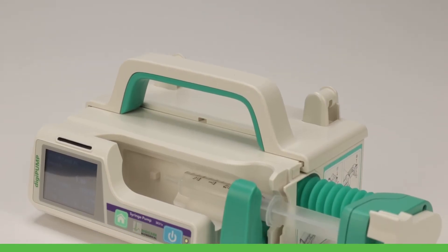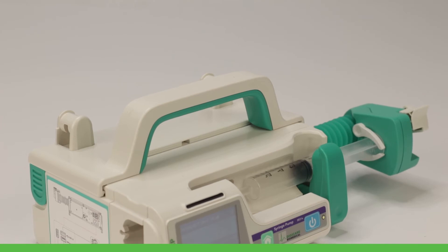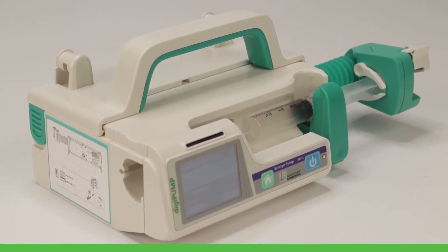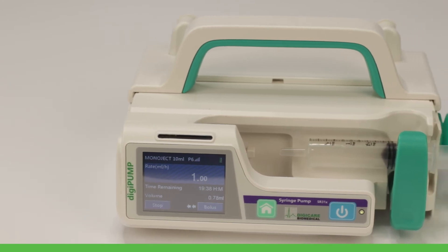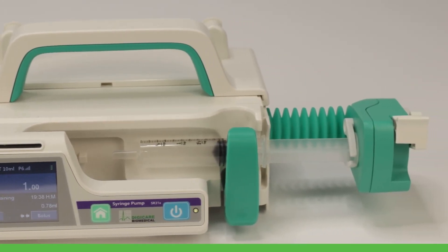The pump can be calibrated for use with any standard size syringe. A dual CPU has been incorporated for added patient safety. The DigiPump SR31X has a battery life of up to five hours and a customizable drug library.